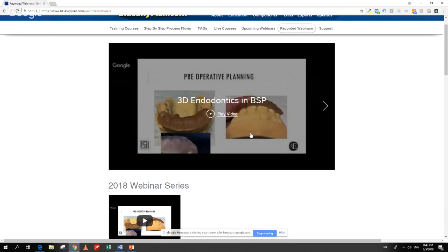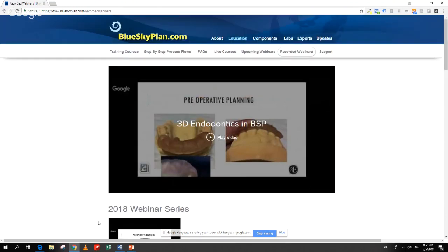To address questions: yes, the DICOM images include all the views — the software renders them into 3D and various 2D views. Regarding scanners: if a scanner can save an STL file, it can be imported into Blue Sky Plan. Blue Sky Plan can load CT scan DICOMs from pretty much any CT scanner, and STL files from any scanner that can create them.